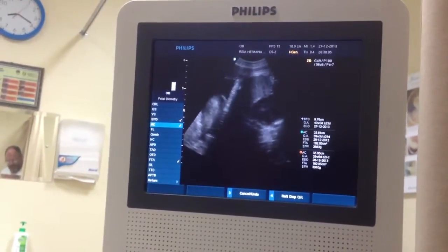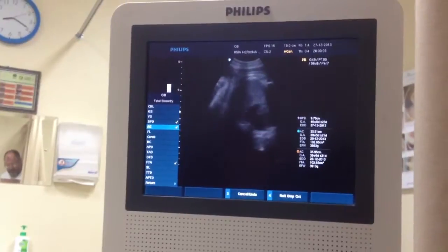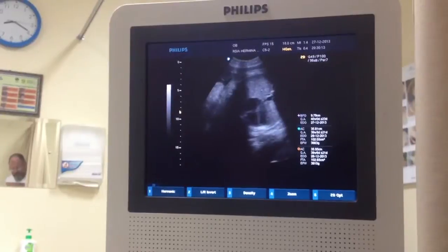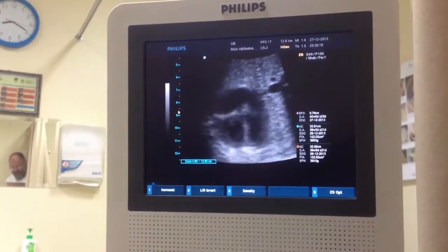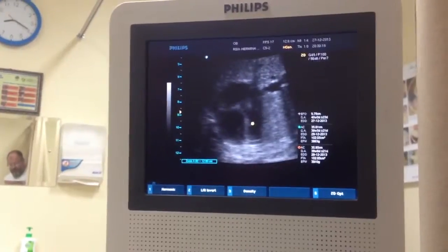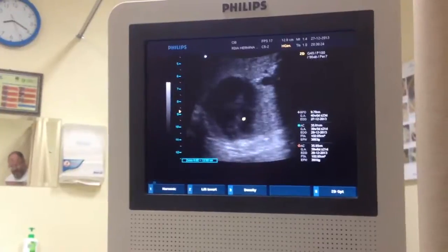Where are the hands, Doc? Okay, after this one. This is the heart. Is the heart healthy? Yeah, it's healthy. This is the four chambers of the heart. This is the left ventricle. This is the right ventricle. So it's good.